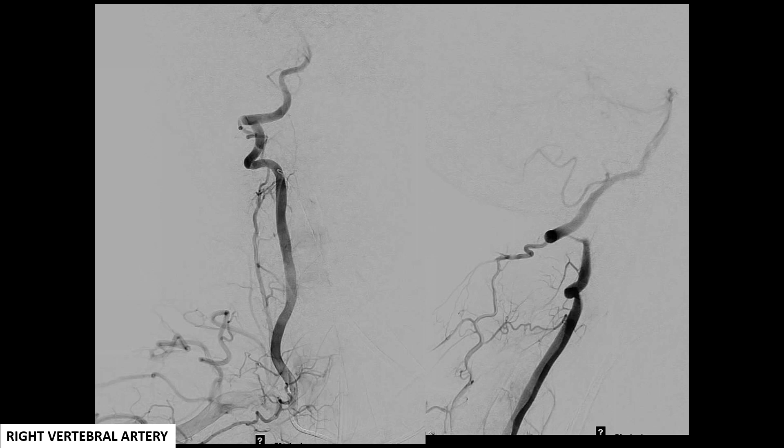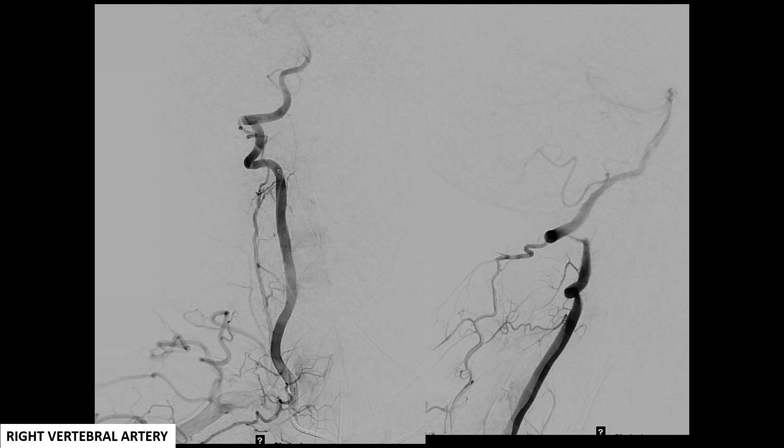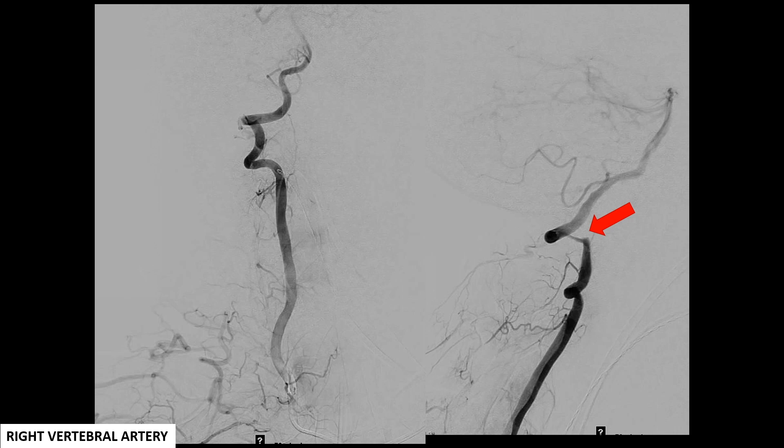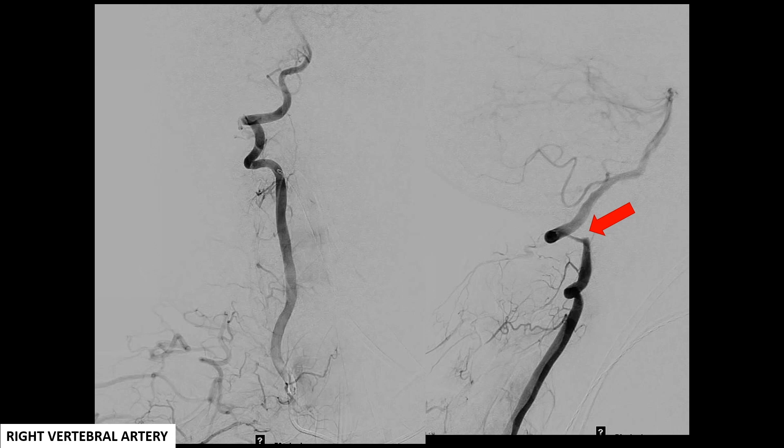Right vertebral artery injection demonstrated slow anterograde filling of the basilar artery. A distal extracranial right vertebral artery dissection was noted with flow-limiting stenosis. Given the significant caliber of the extracranial right vertebral artery proximal to the stenosis, the right vertebral artery was felt to be the dominant contributor to the basilar artery. Additionally, this suggested that the stenosis was acute.